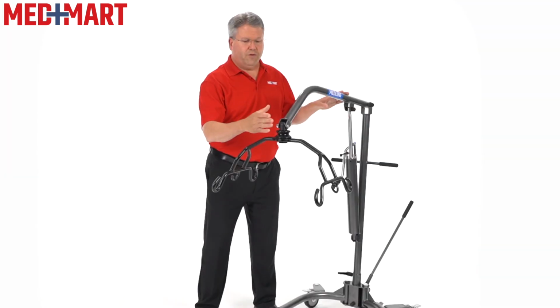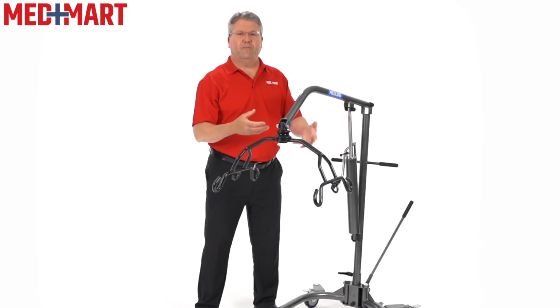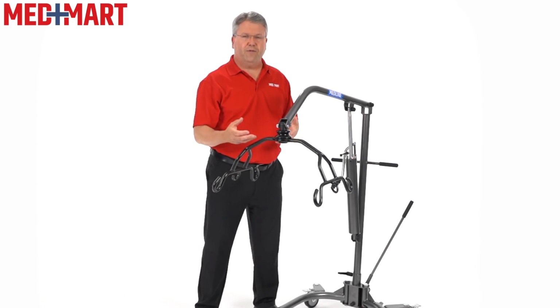Keep in mind, there are a few different things that have to be assembled in this, so all the bolts you see on here do have to be assembled, so just make sure you have someone to kind of help you with that when you do get this patient lift.